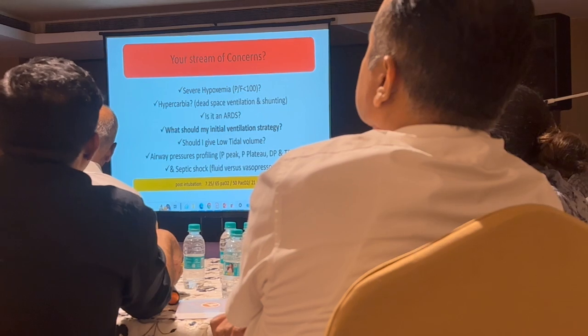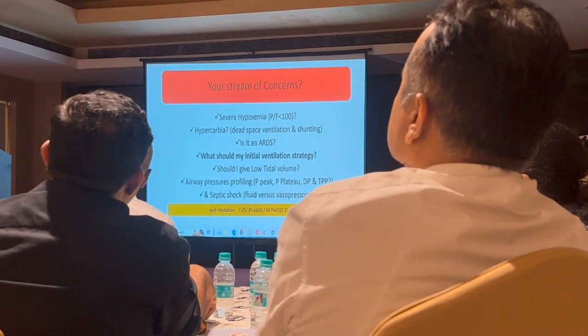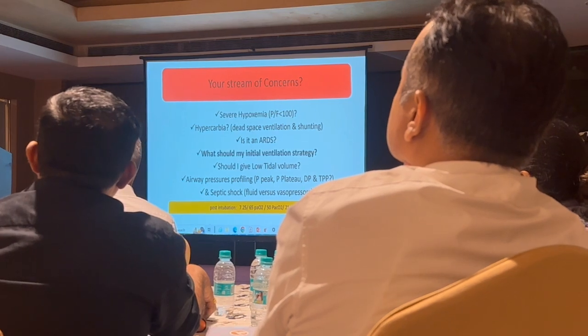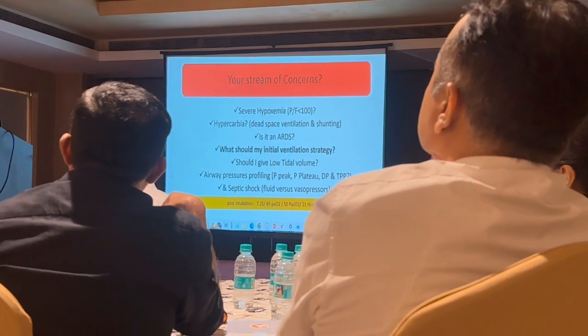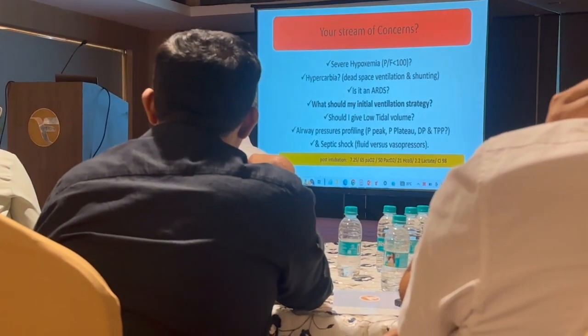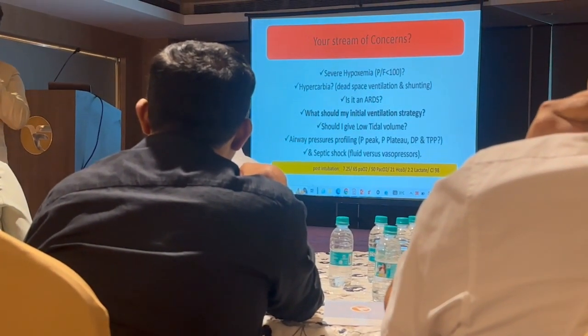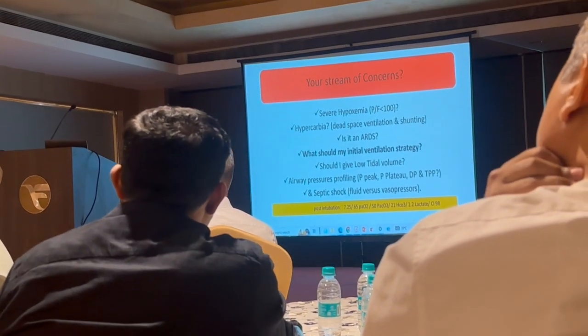The third, as Dr. Sharma also said, on the basis of what we have seen, is it actually an ARDS or is it not an ARDS? Because a lot of things depend upon what is your working diagnosis, right? And should I give low tidal volume if it is an ARDS? Yes, but if it is not an ARDS, Dr. Sharma, in that situation, what should be my volume strategy when you are trying to ventilate them, right?